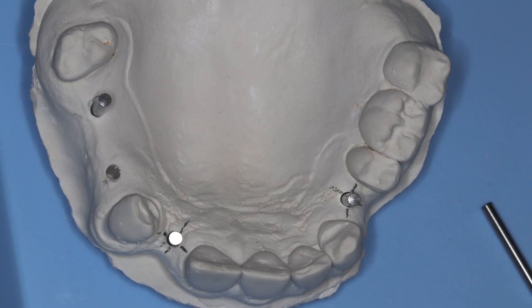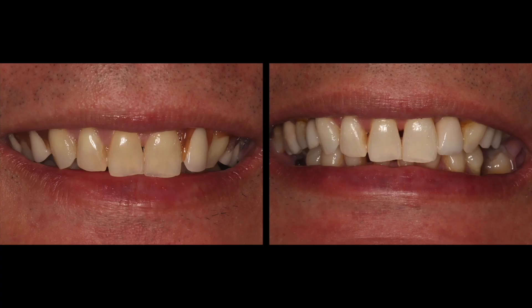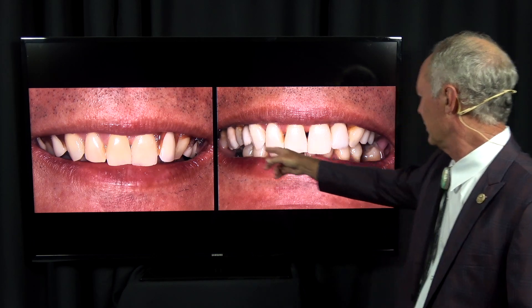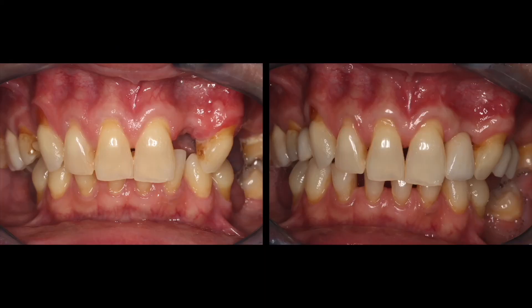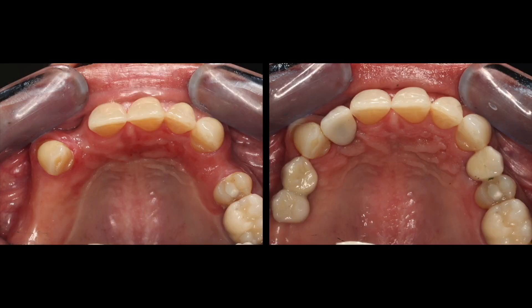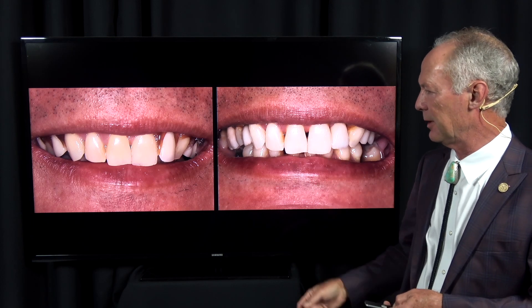This is very accurate and very easy. Here I'm using it in the mouth, and this is the final result — one implant here and one implant here. You can see the complete case in the library at DentistryMasterClasses.com, including the Easy Stent fabrication, how we use it, and the placement of the implants.